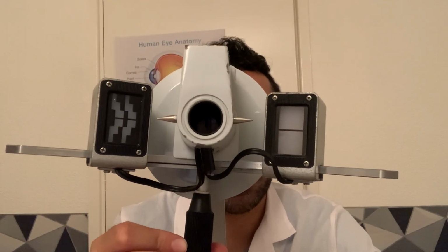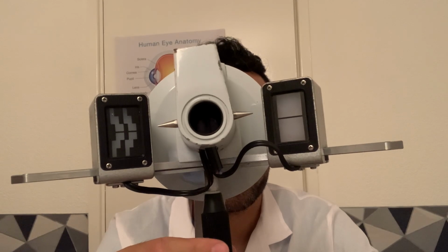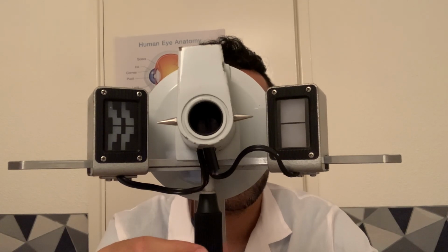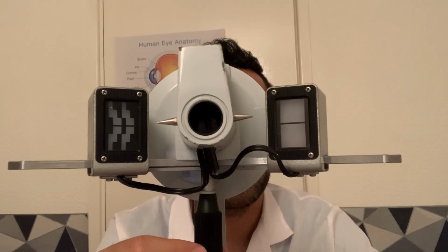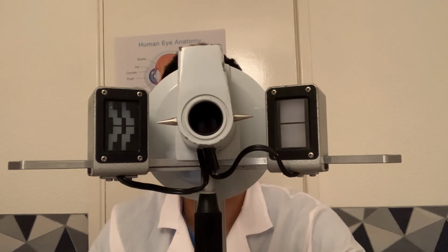So possibly looking at 80 degrees. Okay, 90 degrees, sorry. Just a little bit of fine tuning there. The curvature of the cornea there as the images are touching through the scale is 8.8 again, similar to the right eye, at 90 degrees.